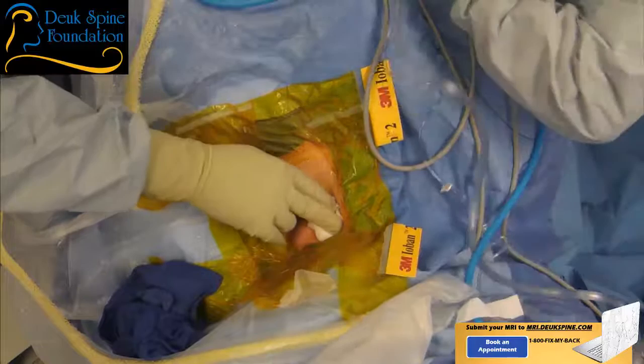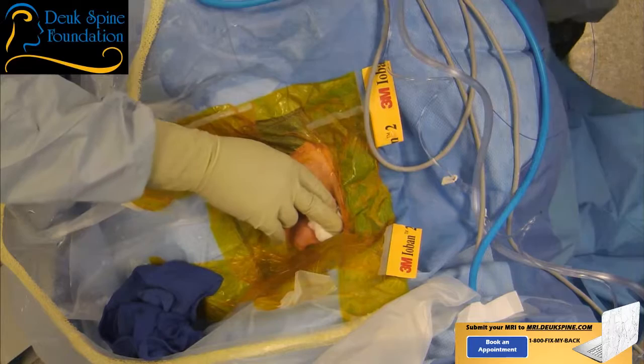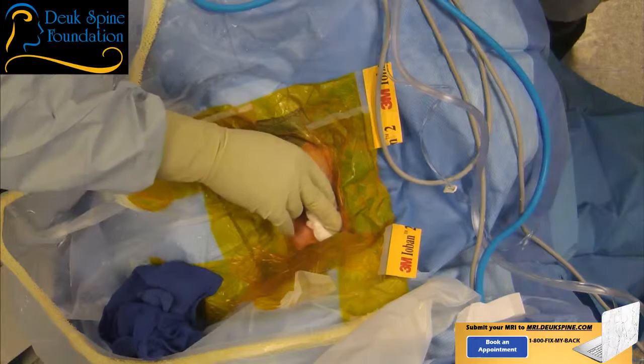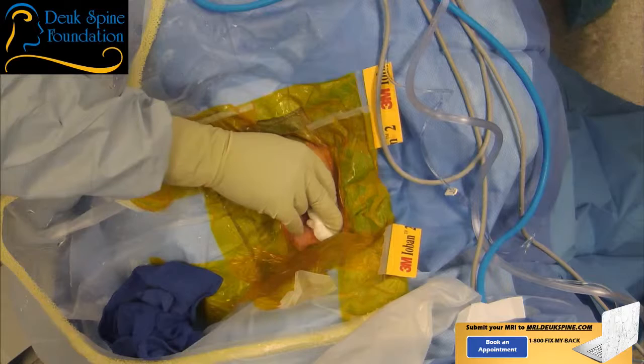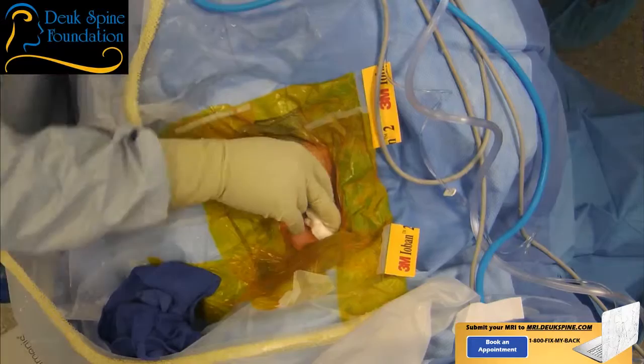There's no bone removed like in a laminectomy, so it keeps the spine stable. The nerve is getting pinched from the front — that's where the disc is — so any surgery that goes through the front has a higher chance of success. Artificial discs, in my opinion, are not as successful because it's very hard to get to the back of the disc to remove the herniation well and still place an artificial disc. A fusion stops the movement. The Deuk Laser Disc Repair doesn't take any of the normal disc out — we just take the piece in the back that's pushing on the nerve. There's no need to fuse or put an artificial disc in because we haven't removed the disc; we just removed the herniation.